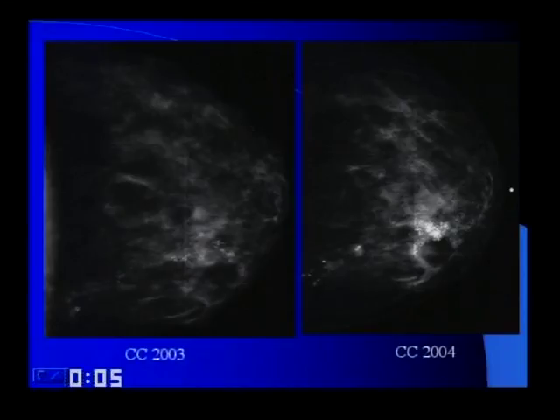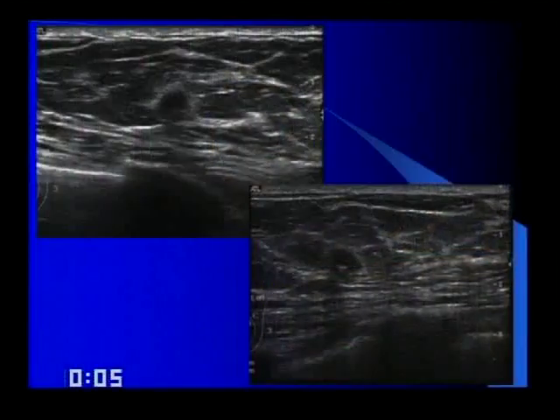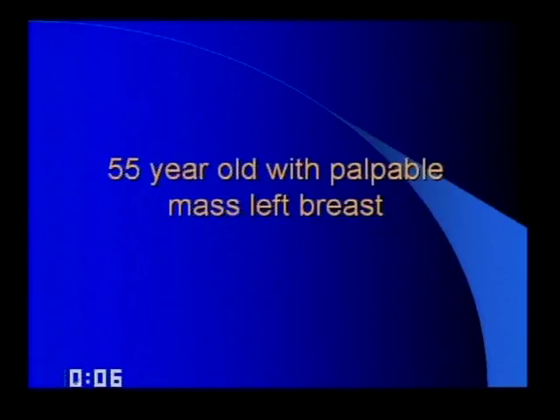And here we did an ultrasound, and that's that little nodule. So here's the invasive component. You can see a calcification within the invasive component. And not only had it invaded the tissues, she also has now, this is the left axilla, an enlarged left axillary lymph node, so she has metastatic lymphadenopathy as well. So this is comedo or high-grade DCIS progressing to invasive carcinoma. Very good.